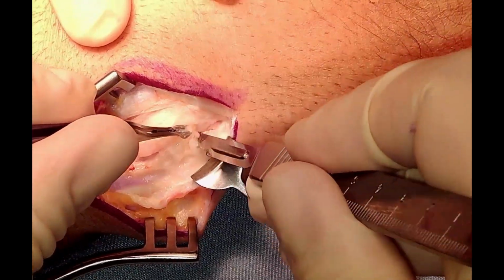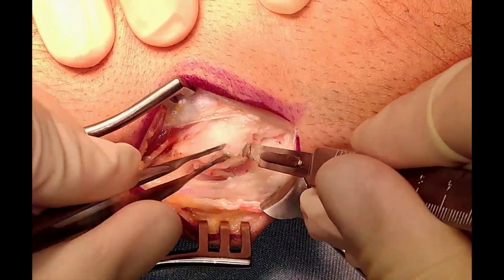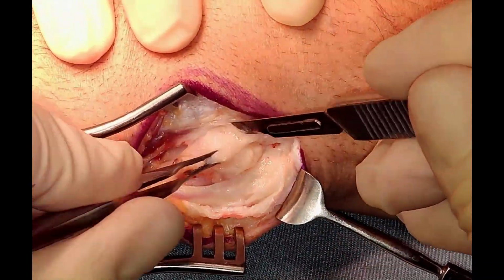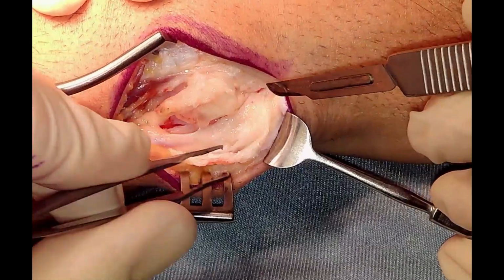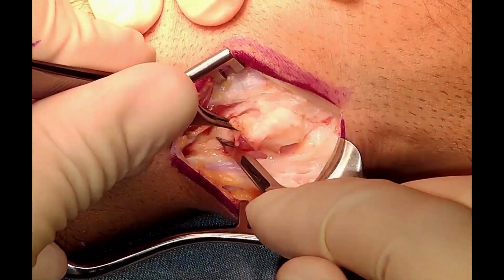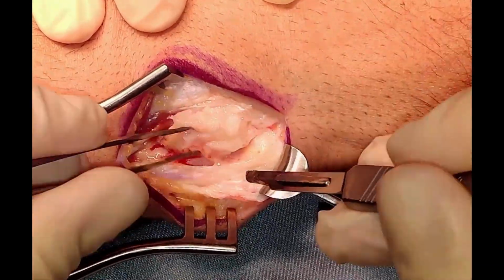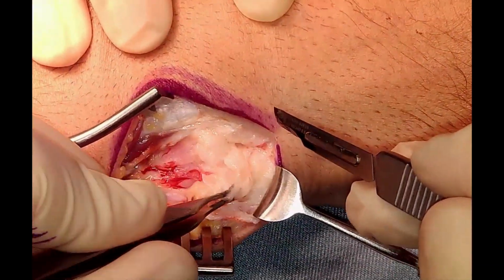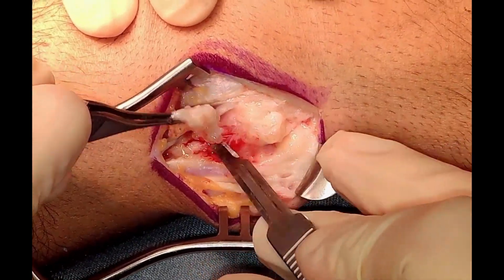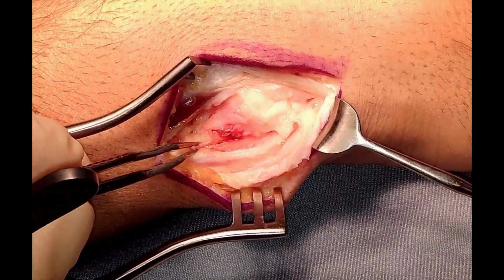Now, as the ganglion involves the dorsal radio-ulnar ligament, some of the fibers will be excised in order to prevent the ganglion from coming back. Part of the attachment of the ligament to the ulnar head will be damaged, and as such it is necessary to reinsert it back. We will use a knotless anchor to reattach it back to the ulnar head.